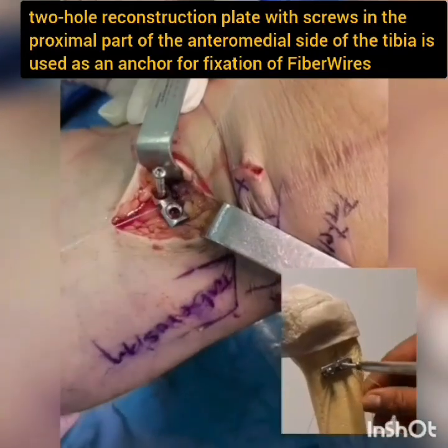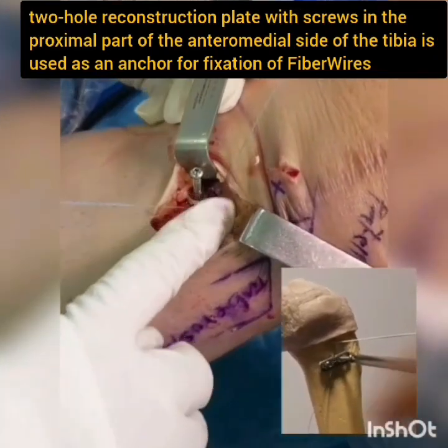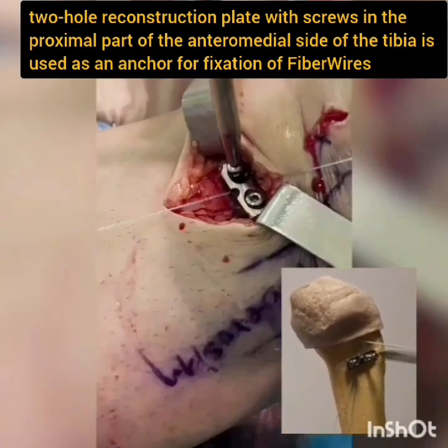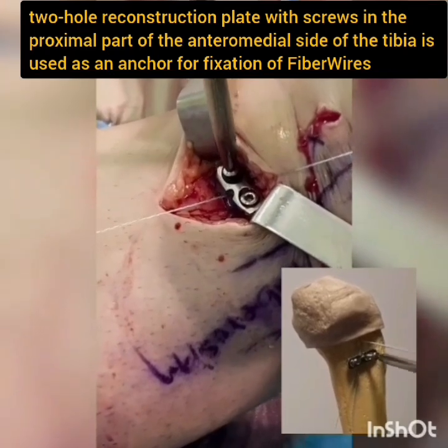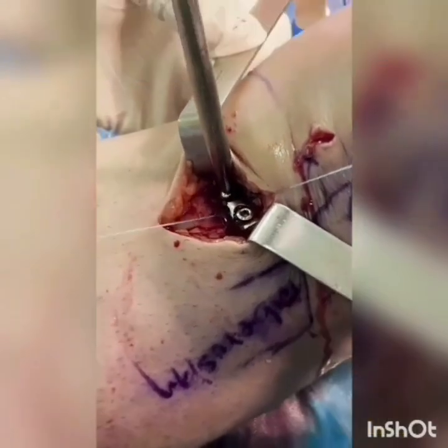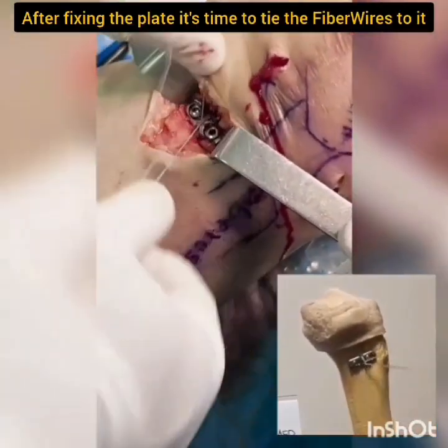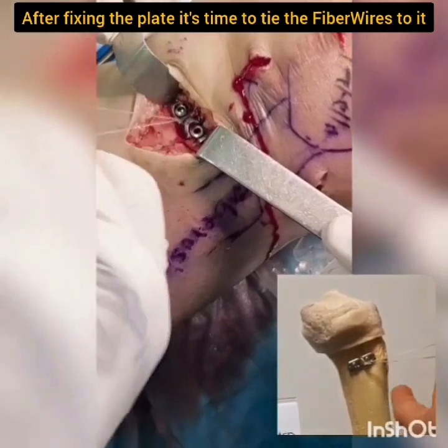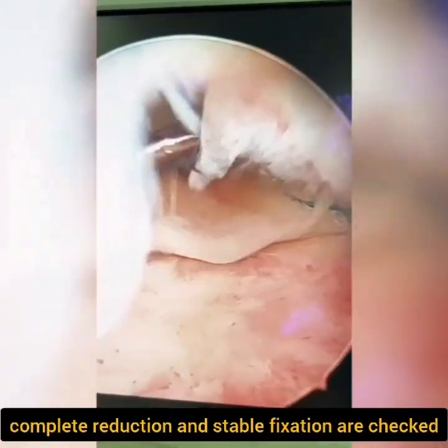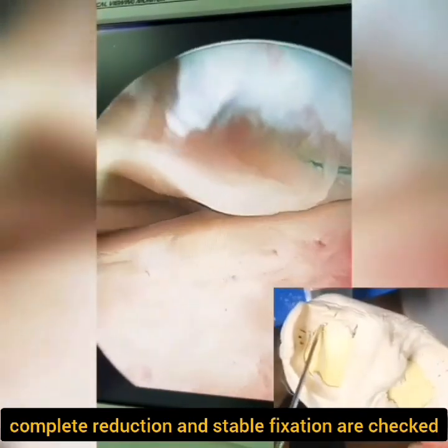A two-hole reconstruction plate with screws in the proximal part of the anteromedial side of the tibia is used as an anchor for fixation of fiber wires. After fixing the plate, it's time to tie the fiber wires to it. Complete reduction and stable fixation are checked arthroscopically for any signs of instability or loosened repair.